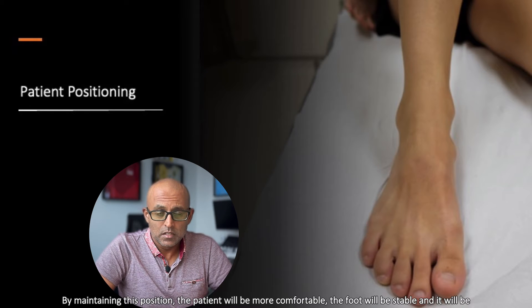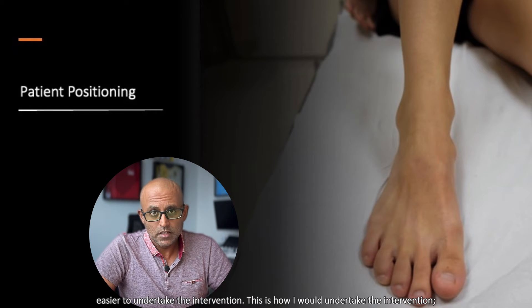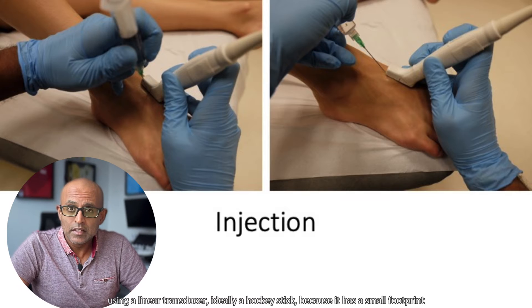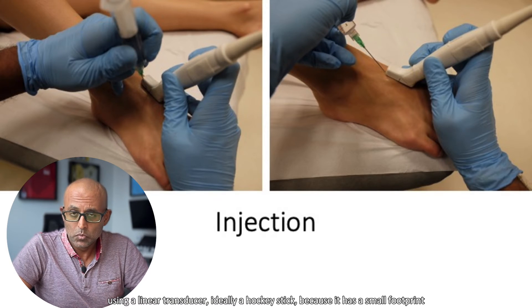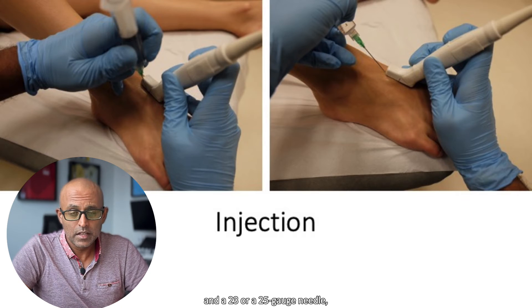By maintaining this position, the patient will be more comfortable, the foot will be stable, and it will be easier to undertake the intervention. I would undertake the intervention using a linear transducer — ideally a hockey stick because it has a smaller footprint — and a 23 or 25 gauge needle.